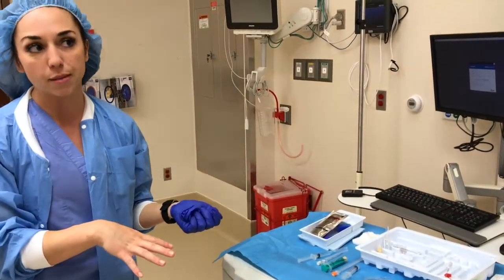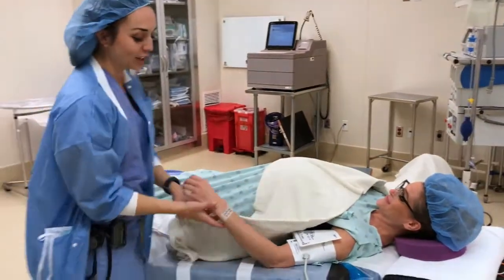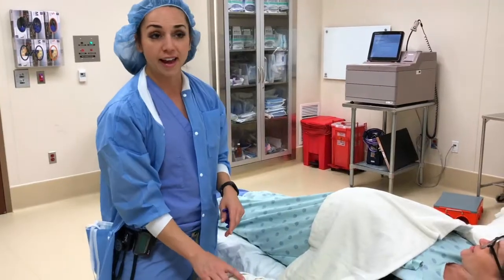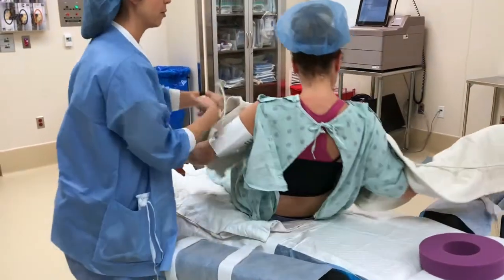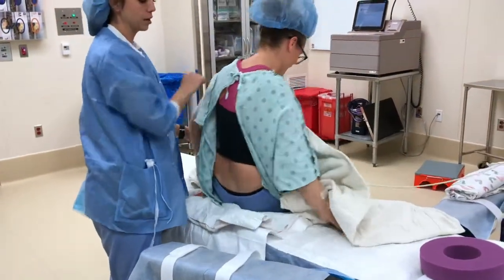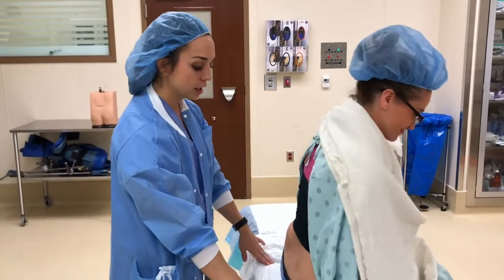Get all of this ready while they're monitoring baby. Then you'll head over to mom, and to perform the timeout, you'll obviously look at her wristband. Once you've done that, the nurse will help you sit the patient up during this part. Obviously, you want to make sure that they're far enough back towards you to ensure adequate positioning.